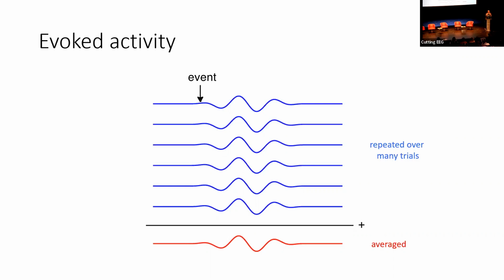You could say each of the frames of the video or each of the scenes in the video is going to elicit a brain response. So rather than having one stimulus, one longer response, you can think of it in a convolutive model. Basically, you get the temporal summation of all of these responses. That also means that thinking of this more in terms of a GLM analysis that we use with fMRI data, in a way makes more sense.